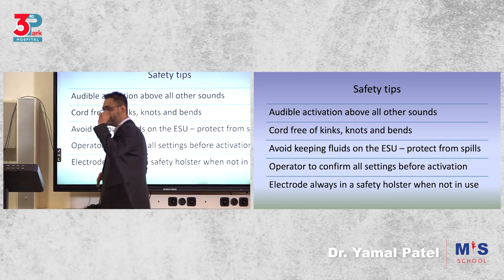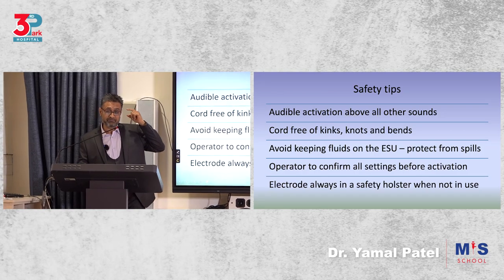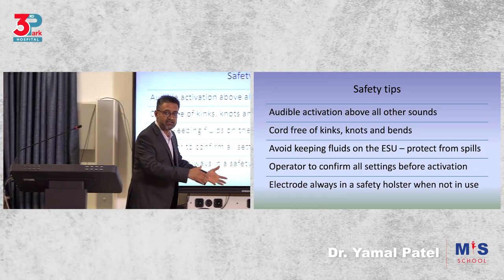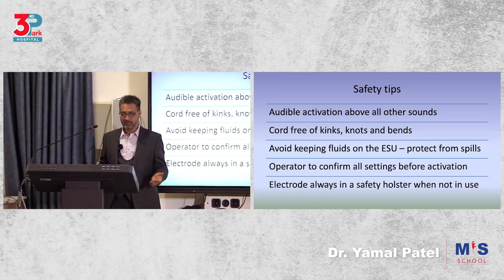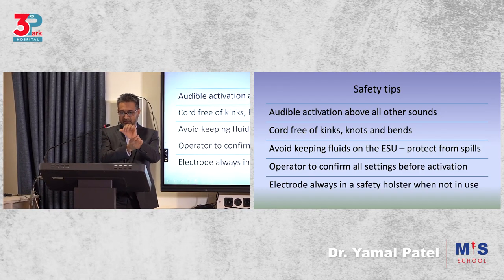Okay? So it should be audible. It should be loud when you activate it. So if someone activates it by mistake, someone hears it immediately. The cord should be free of kinks and knots, so don't try and have knots in the cord.